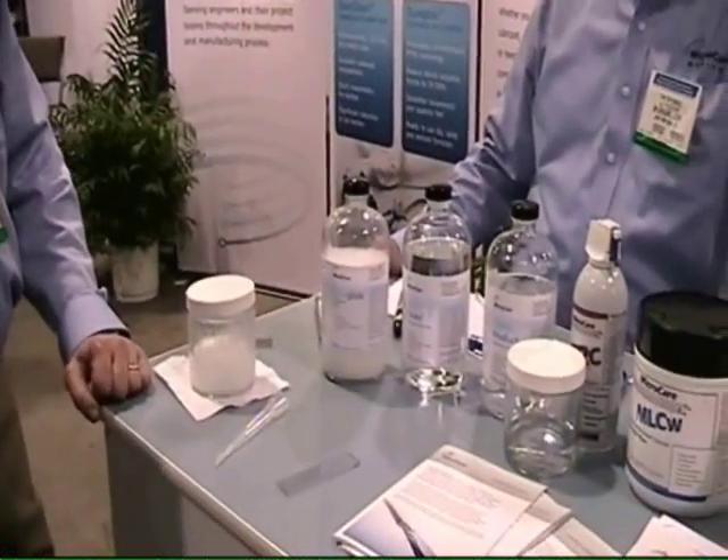Hi Sean, I'm Jay Terrigne with MicroCare Medical at the MD&M Show in Anaheim, California. And today we are introducing DuraGlide, which is a proprietary PTFE coating that would be used on medical devices.